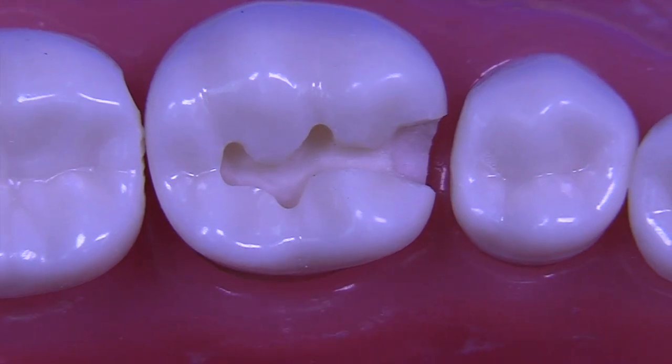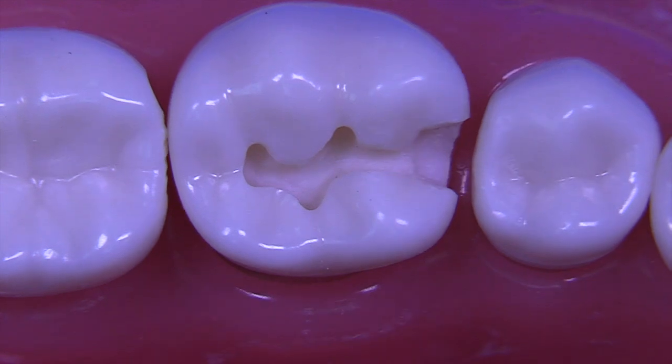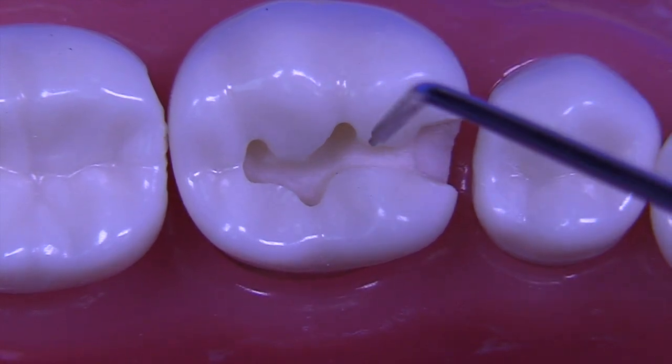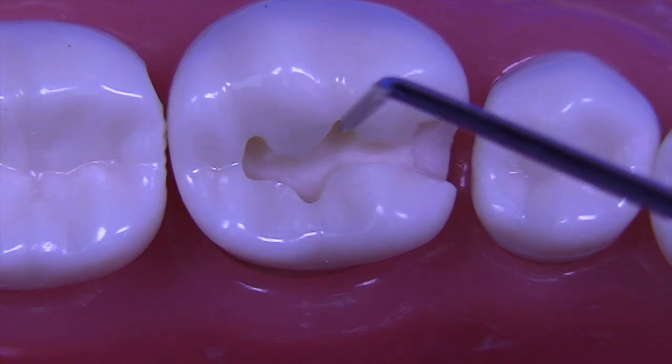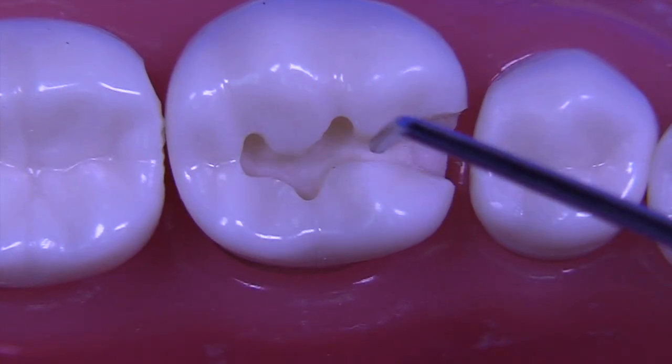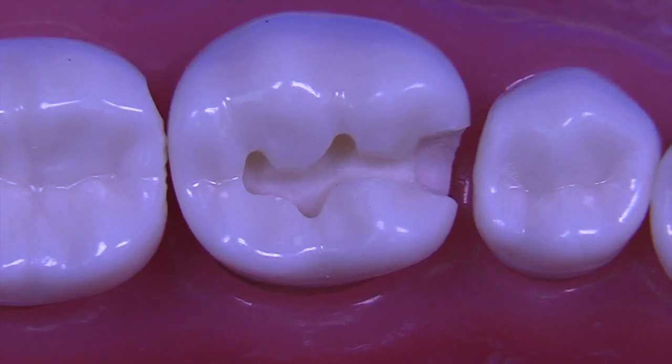Now let's think about the flow. Does this have nice flow? And I think it does. There's a little bit of a sharp edge here and here on the occlusal portion, but the rest of it has, generally speaking, very nice flow. So I think in that area you did quite well.